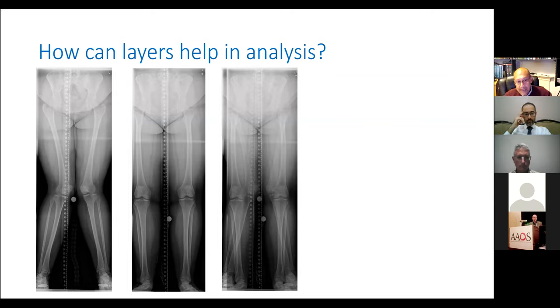When you repeat the X-ray with the patella centered forward, you see the femur in a much better AP projection. But if you look at the tibia now, particularly at the ankle, you have an oblique ankle projection. However, the first image gave a good AP of the tibia. The second image gave a good AP of the femur. What has happened in the two images is you have positioned the patient to effectively cancel the malrotation.